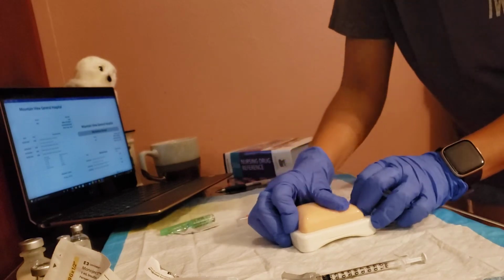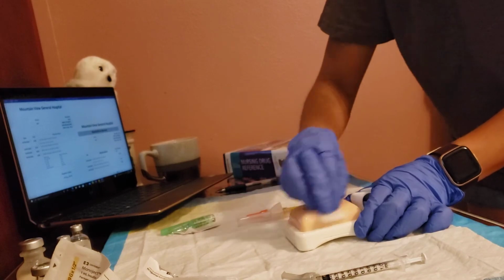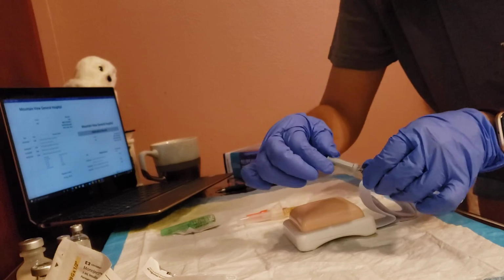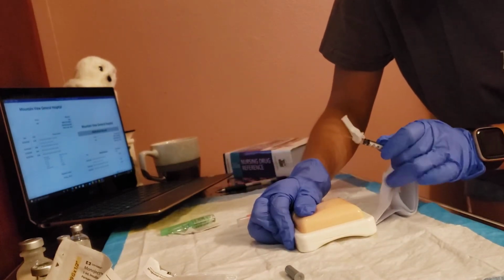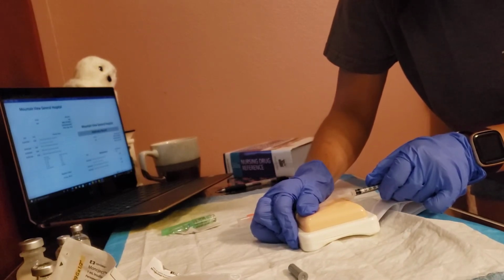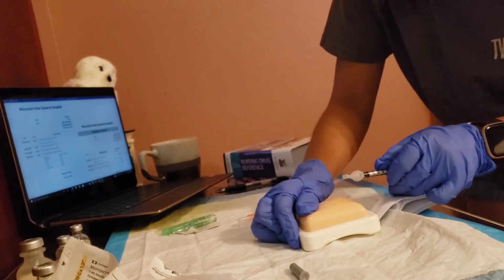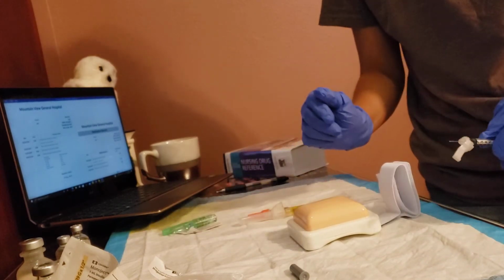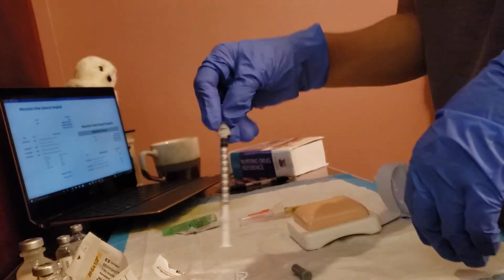And I'm gonna want to pull back. I've cleaned his forearm, and I'm gonna want to pull back, and I'm gonna take this off, pull back, and I'm gonna want to go in at a 10 to 15 degree angle, parallel to his skin there. And I gave it and I released, and I'm going to put my safety on and throw that in the sharps.